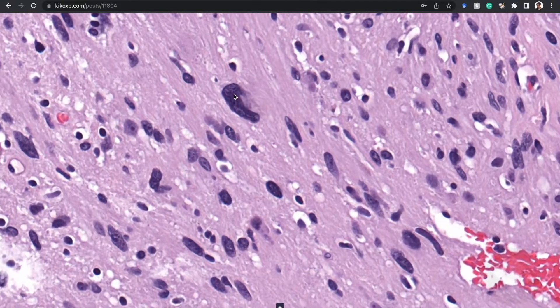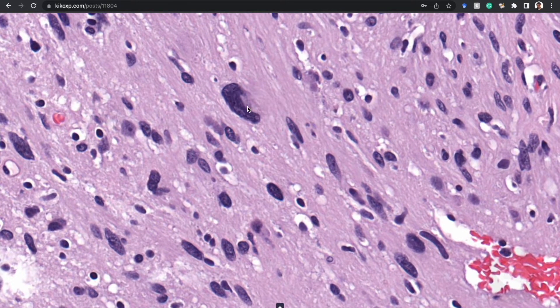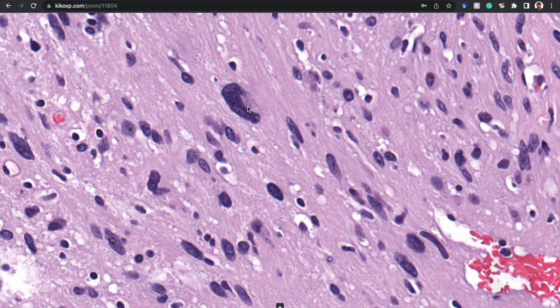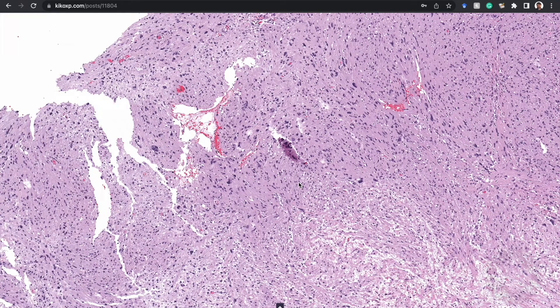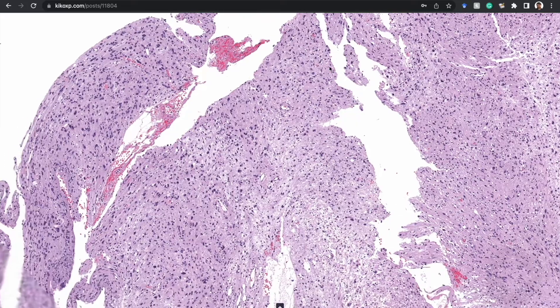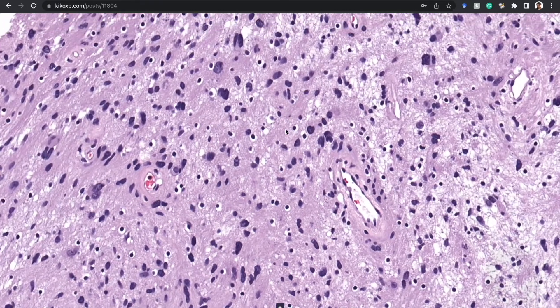I want to point out the scattered hyperchromatic pleomorphic cells throughout — a common finding in schwannomas. Other nerve sheath tumors often have this too; in schwannomas, I would say they usually have scattered atypia — or as my residency program director, Suzanne Powell, a neuropathologist, liked to say: random pleomorphism. Usually though, mitotic activity is not robust. You may find occasional mitoses, especially around areas of inflammation and hemorrhage.